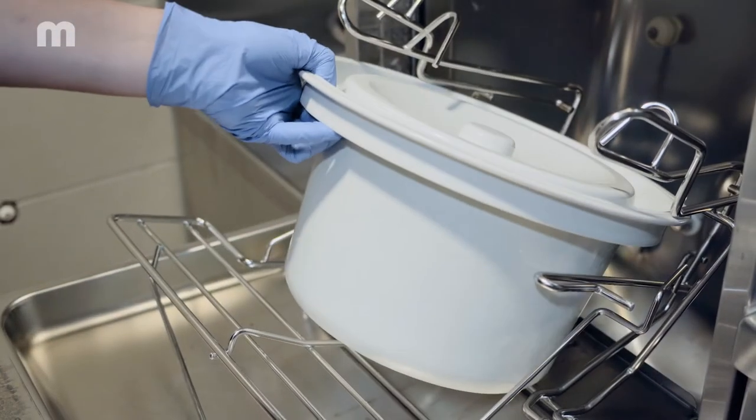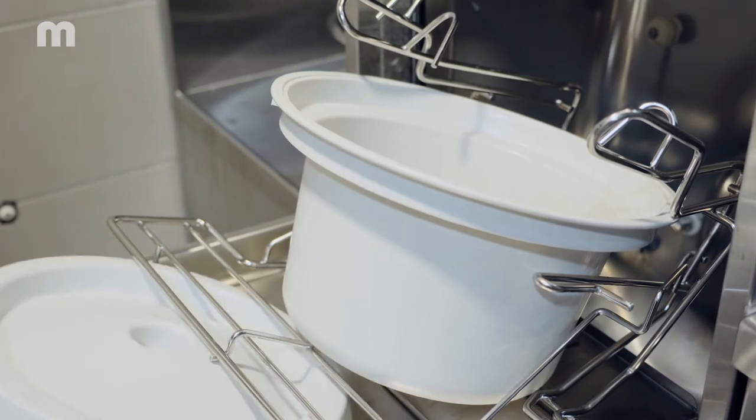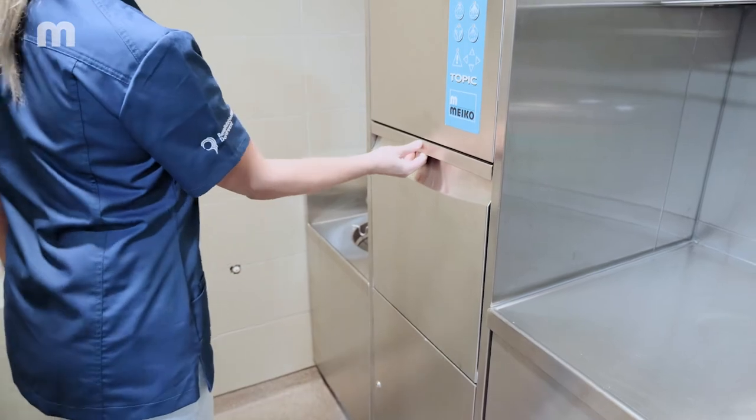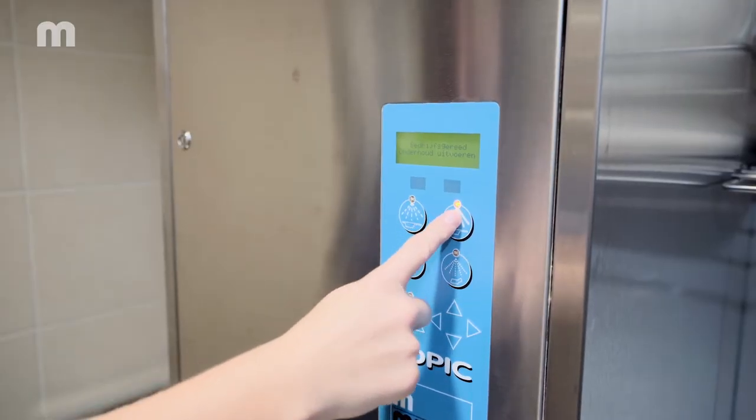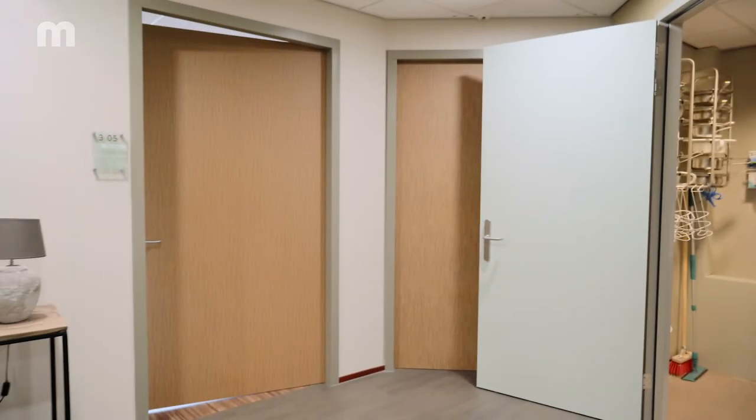Using your clean hand, close the appliance door and select the required program. Once the door is closed, the contents are emptied hygienically inside the appliance. The contaminated glove can now be removed and disposed of in the correct manner.